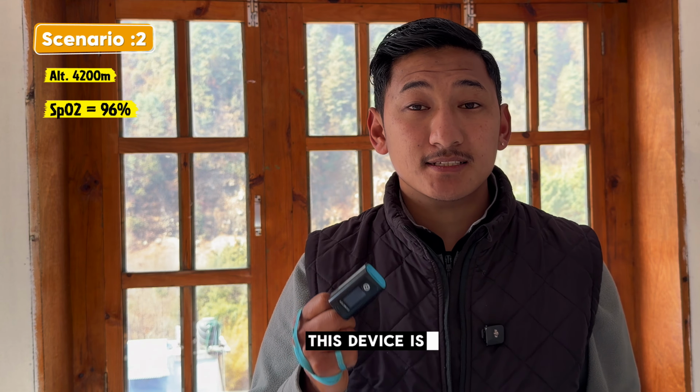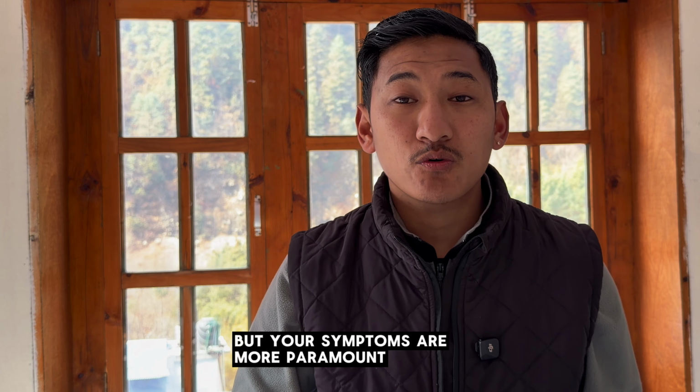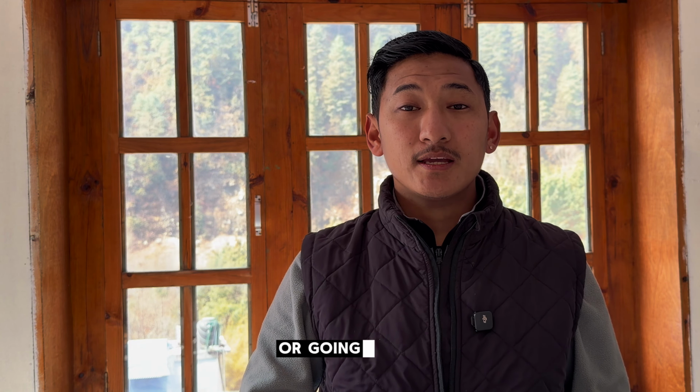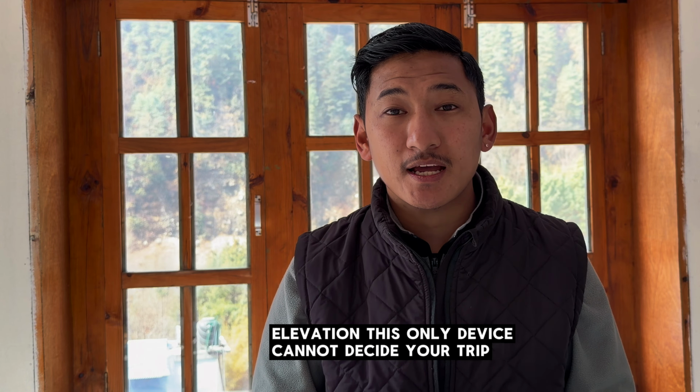This device is a guide, not a god. Your data are powerful, but your symptoms are more paramount when you're hiking or going to high altitude elevation. This device alone cannot decide your trip in high altitude.